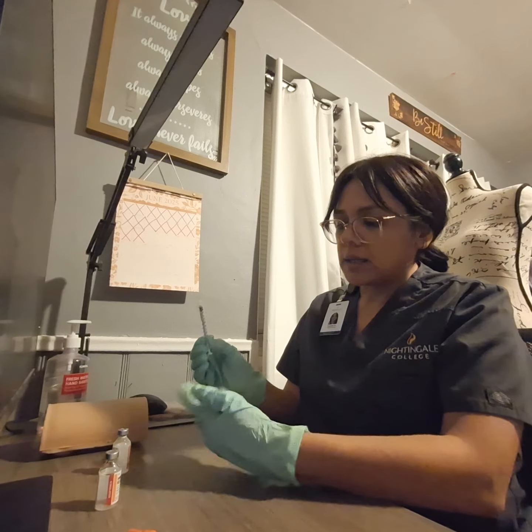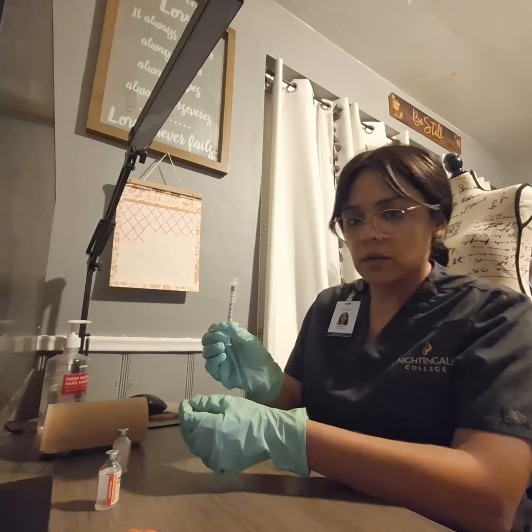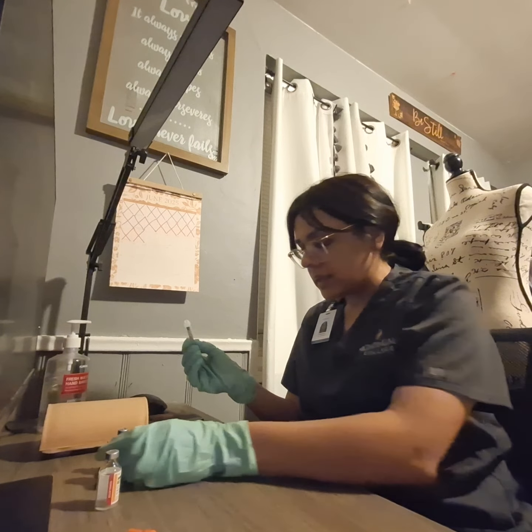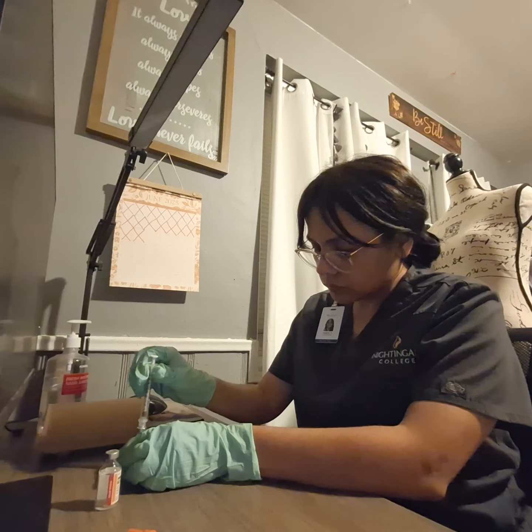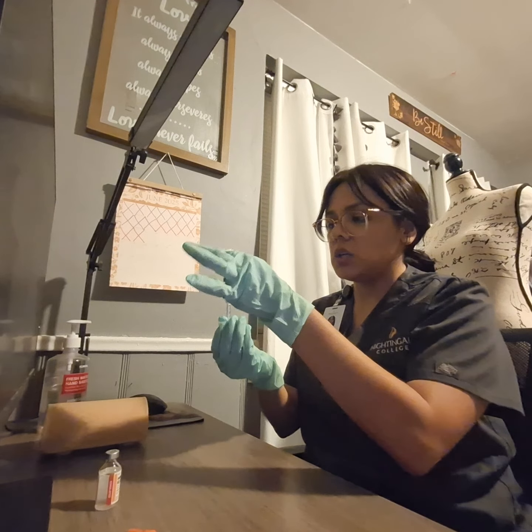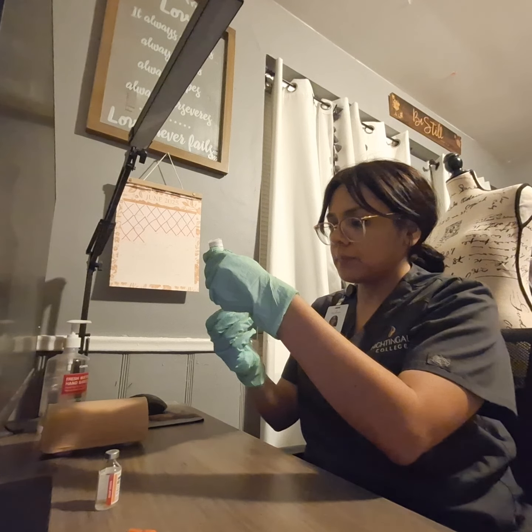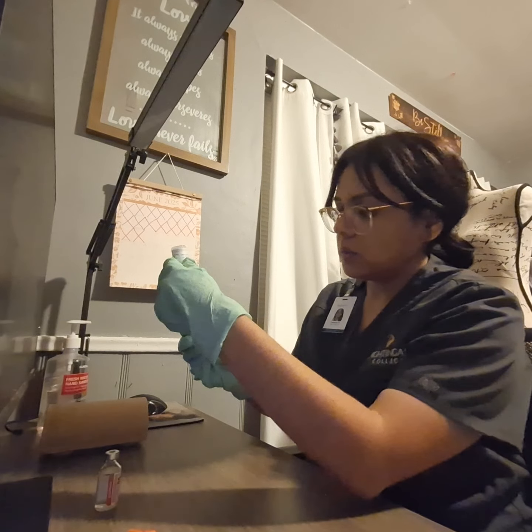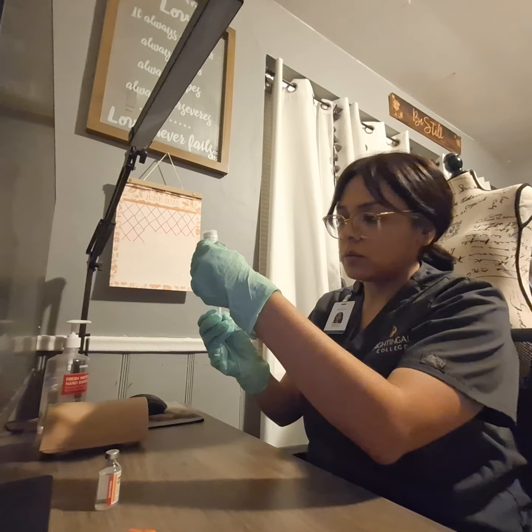Again, I'll verify against the bar, making sure that everything is accurate. So I have the 4 units here of regular insulin. And then the next thing that I'll do is that I'll take the NPH here. Insert that. And as I'm doing this, I'm making sure not to push any of the regular insulin into the NPH. And here, I will be extra careful not to overdraw the insulin here. If I do, I have to start all over again.